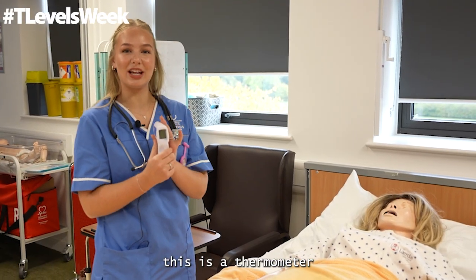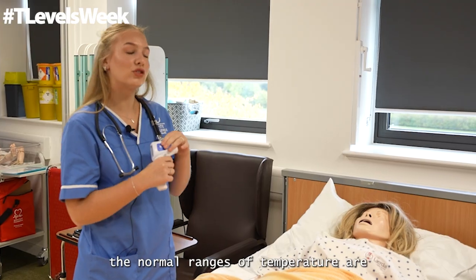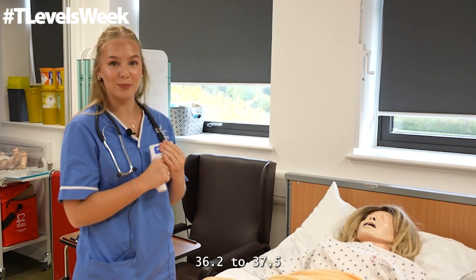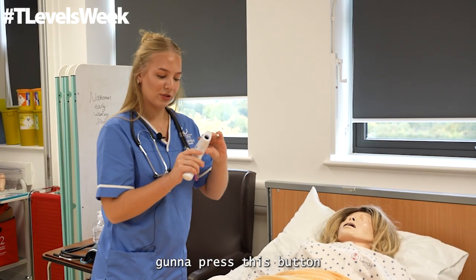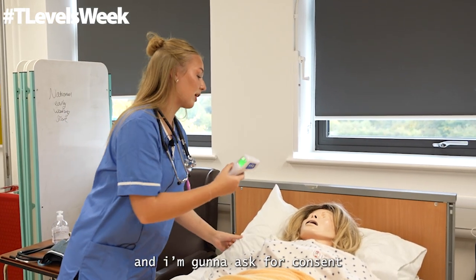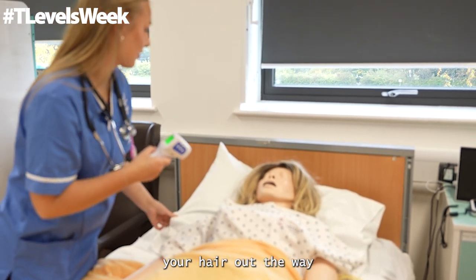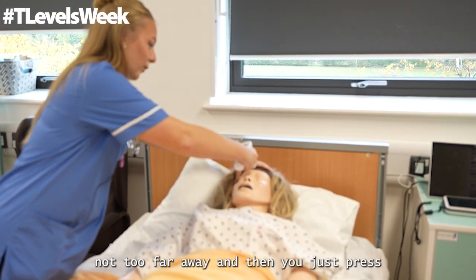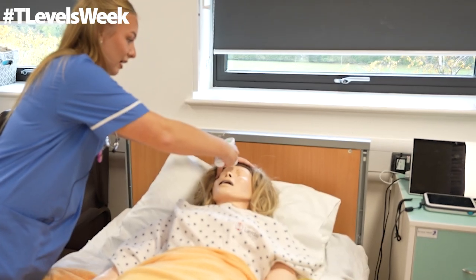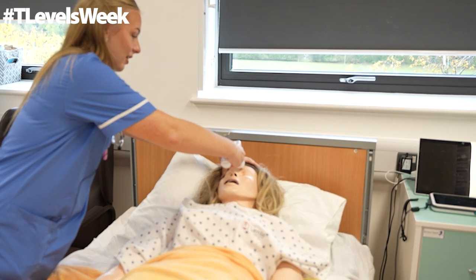This is a thermometer. This is a non-invasive thermometer. This is what we use to measure patients' temperature. The normal ranges of temperature are 36.2 to 37.5. And so what I'm going to do is I'm just going to press this button and I'm going to ask for consent. So Susan, is it alright if I measure your temperature? I might have to move your hair out of the way. And then put it not too close to the head, not too far away, and then you just press the button again and it should give you a reading.